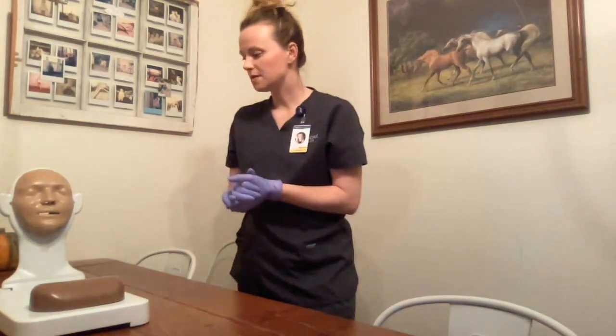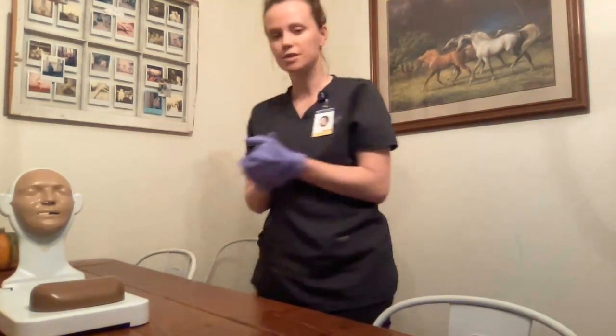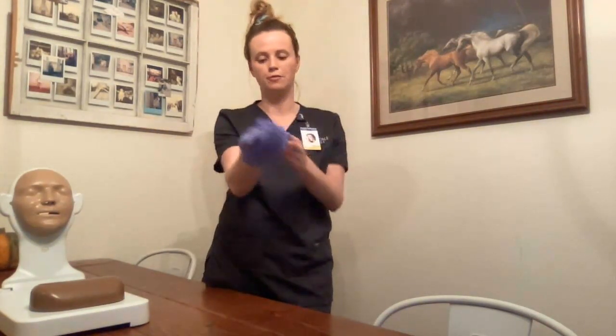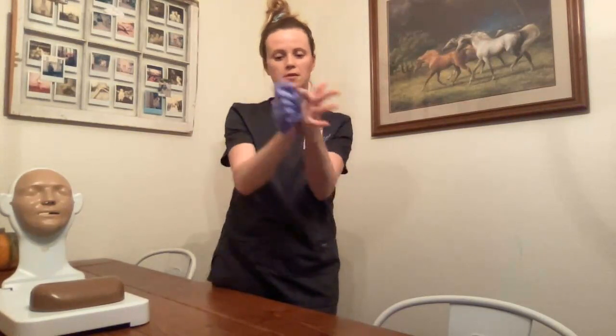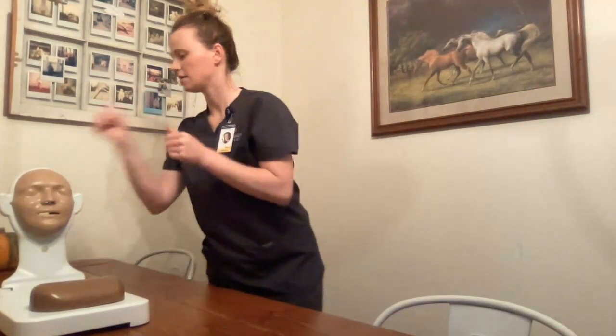I will gather the rest of my supplies and dispose of them. Mrs. Smith, are you comfortable? She is comfortable. She has a call light and her bed is in the appropriate position. I'm going to remove my gloves, dispose of my trash, perform hand hygiene, and go document my results.